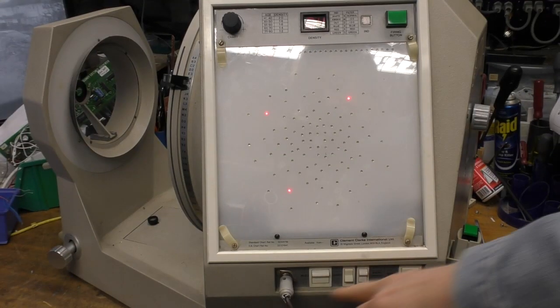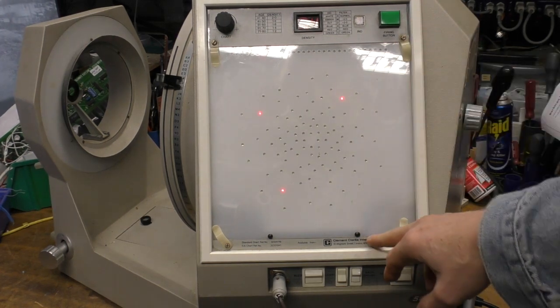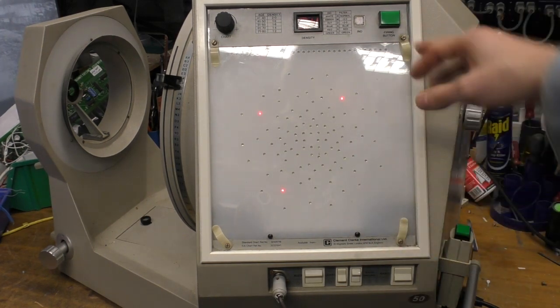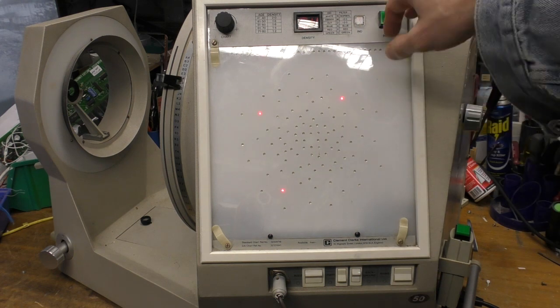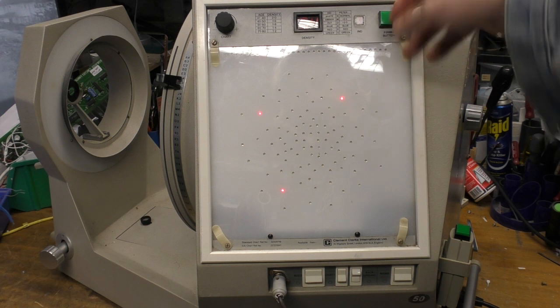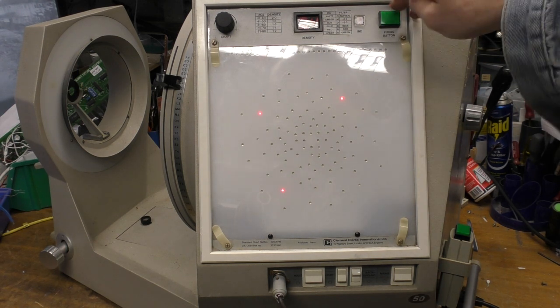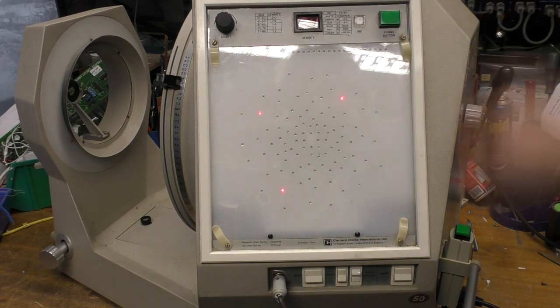There's a few switches on the bottom. One selects the flash mode, so the flash is actually generated by a xenon flash tube, a characteristic pop when that fires. And you can either have it fire immediately when you press the button, or you can have a delay and it fires at the end of a short beep. So that's to give a prompt to the patient.